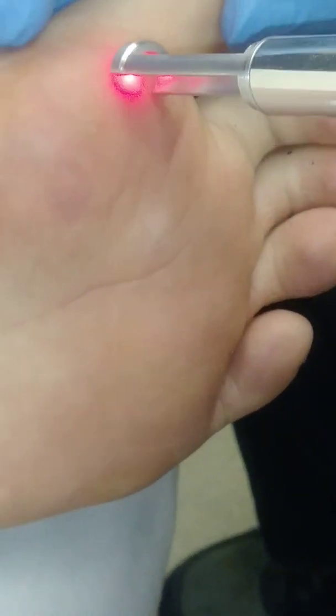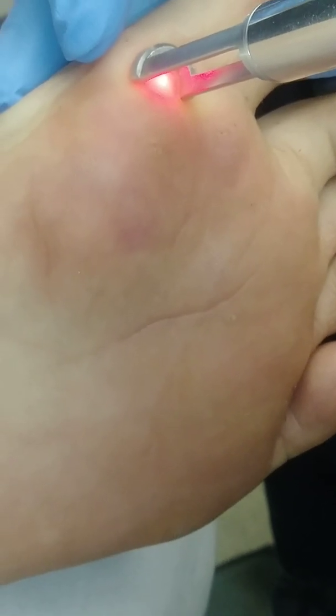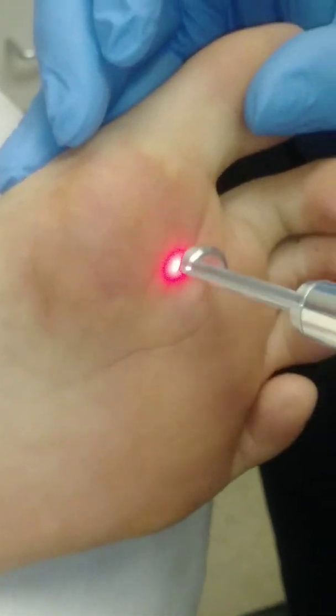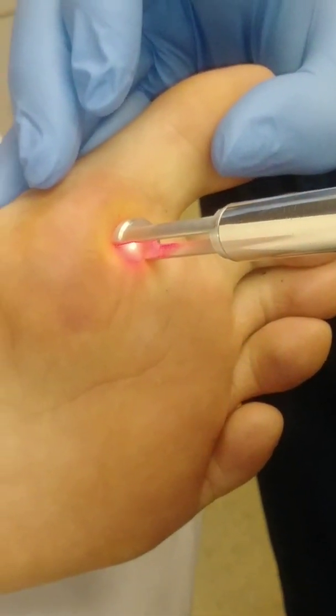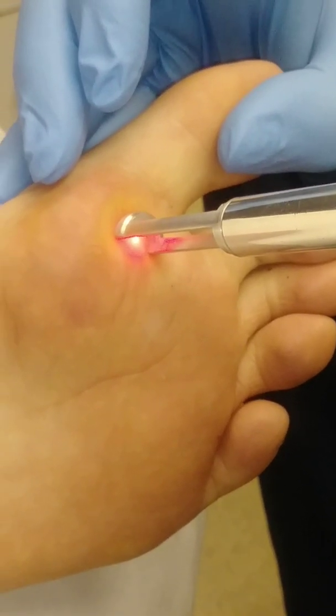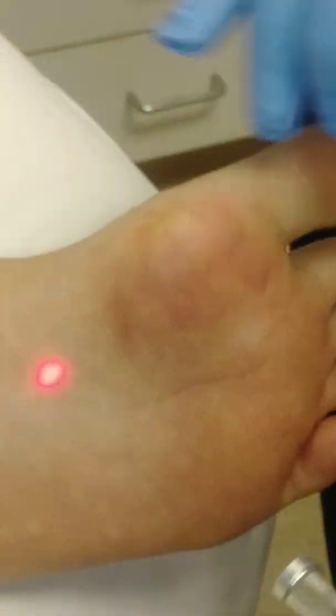Let me just treat these last two again. Usually we'll put a little antibiotic cream on these, which is really a burn cream. Hers are now so small — nothing like they were to start with — and she's not really felt any discomfort afterwards. Because they are so small, we're still treating them pretty aggressively with this.